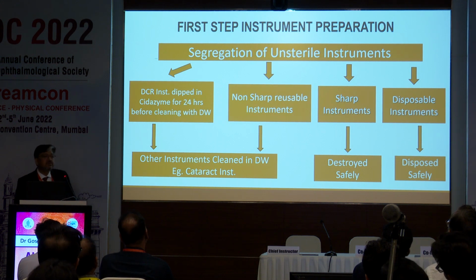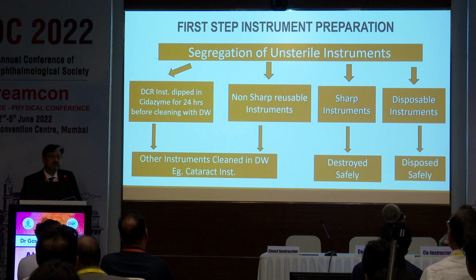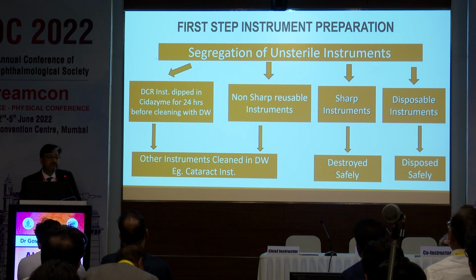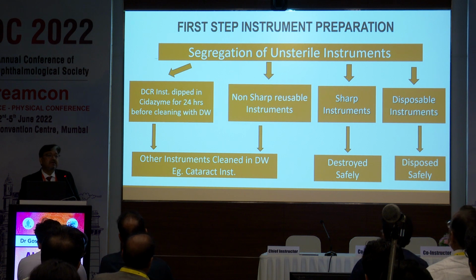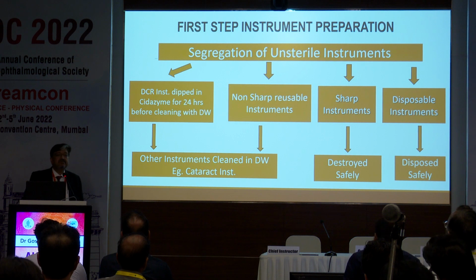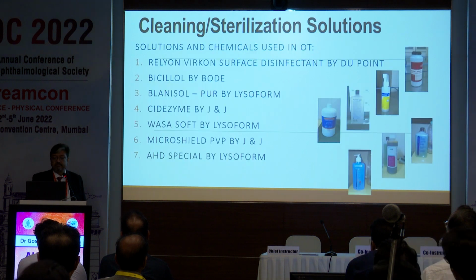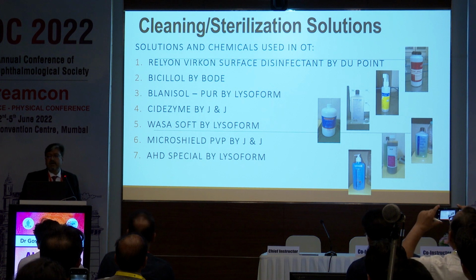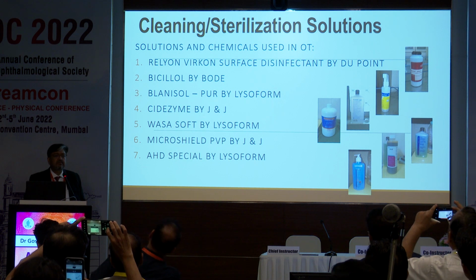Here, if you're doing a normal cataract surgery, you may just clean it with non-ionic solution. But if you're doing some very infected surgery, for instance a DCR surgery, a lot of organic material and bacteria may get stuck onto the instrument. So these should ideally be treated with enzymatic treatment for 24 hours before they are taken up for the next case. So there are a lot of solutions, and some of them Dr. Shugota has already mentioned, and I'm sure our esteemed speaker, Dr. Bhaskar, would be speaking about later.